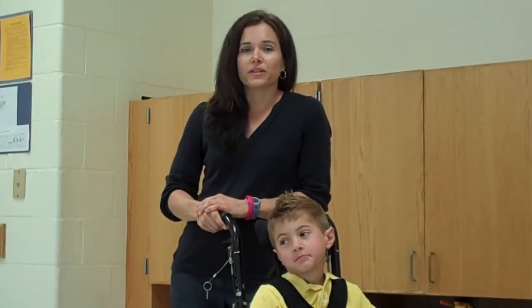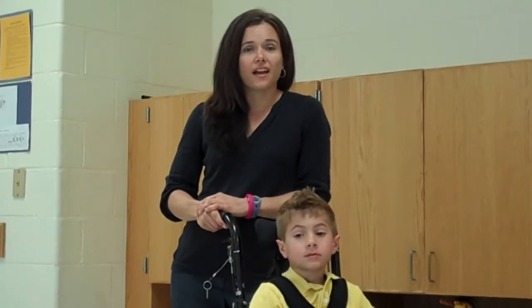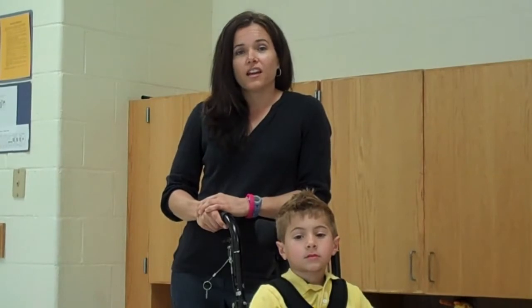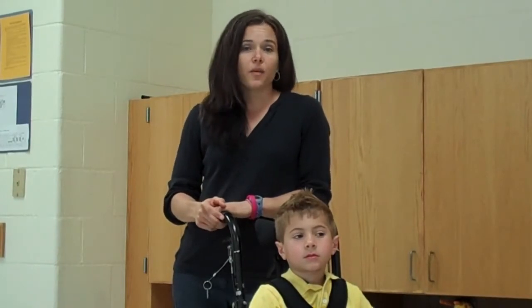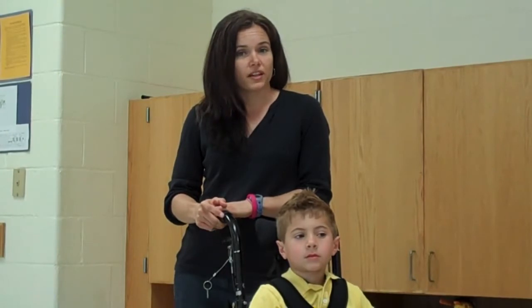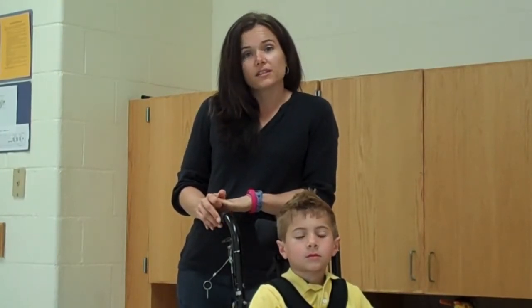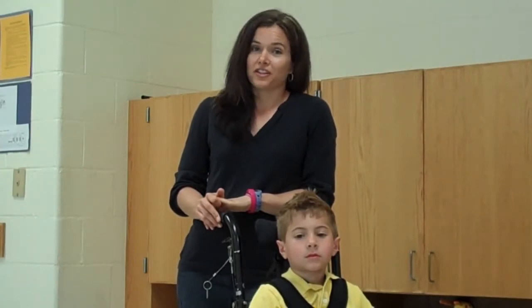As a physical therapist in the school setting, I work closely with children with disabilities and school staff to train them on positioning and safety during the school day. During this class, you'll learn to identify common wheelchair parts and how to use them, identify proper positioning, and also identify common mistakes with positioning. You will also learn common safety considerations during school routines and safety evacuations.